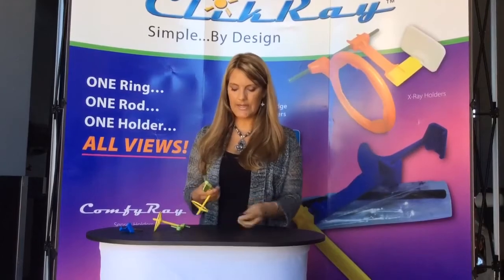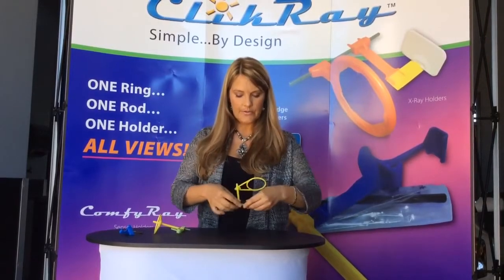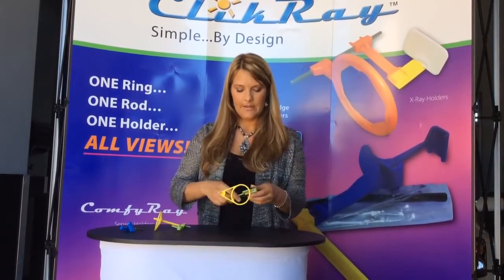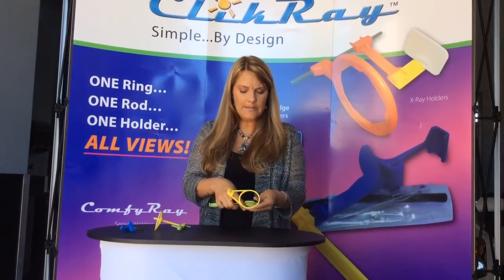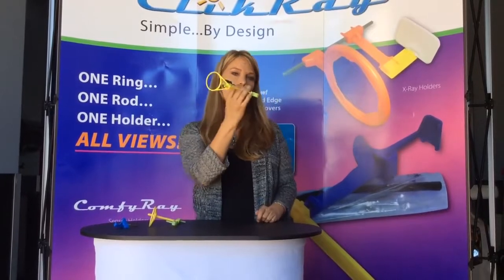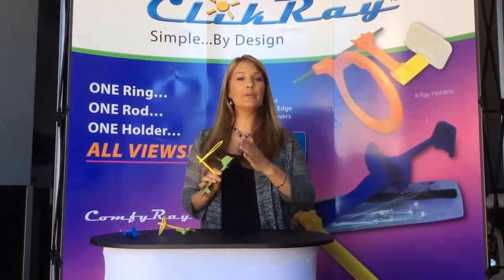So we're going to take our sensor and slide it into the sensor holder. And there's also another little clip right here where you can tuck the tail and keep it out of the way. So the nice part here is we're just gonna slide this all the way up to the top, and click our ring all the way up to the top, and we're gonna be able to take an upper, flip it, and take a lower and a lower. We're gonna click the ring in the middle, slide the sensor to the middle, bite wing, bite wing, bite wing, bite wing. Then we're gonna slide this to the lowest position, click this to the lowest position, and take a lower, lower, flip it, and take an upper, upper. All of your posteriors are done.